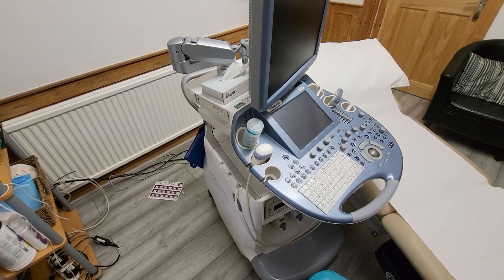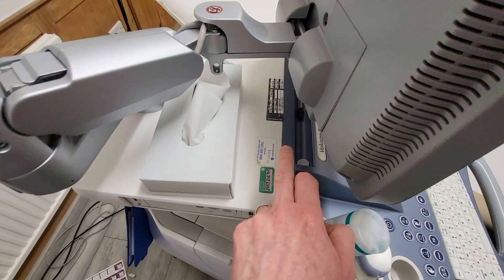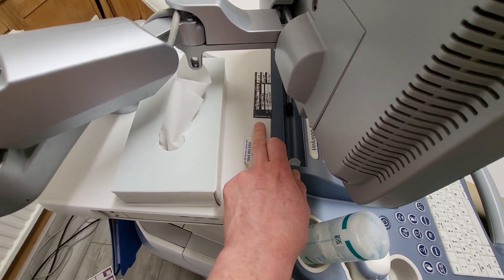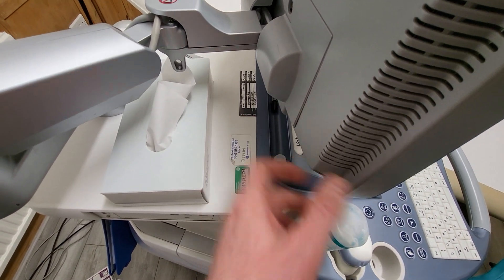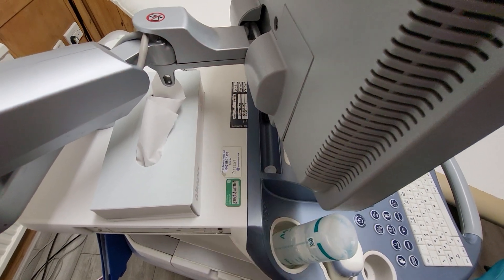So my advice is if you come across any equipment like this, steer clear of it. As you can see here, there's a particular label here from a medical company that come in and calibrate the machine, and they also do a medical PAT Test on it as well.